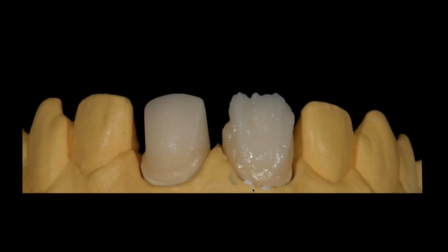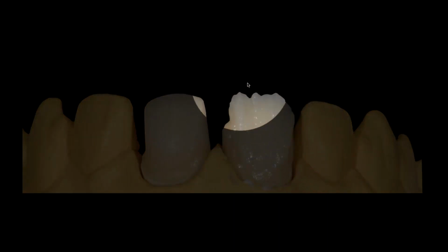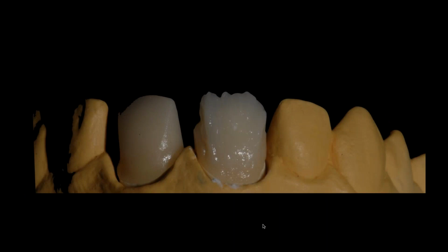So why did I pick the A4 for an A1? Because it's going to give me the warmth I need without having to use a different material or put stain on the crown at the end. I want the color inside, not on the outside. Notice the brightness that you can see here, and notice how it transitions up. So that's an ideal internal structure for me, and I'll shoot it under a warmer light so you can really see the difference and the effect of it.